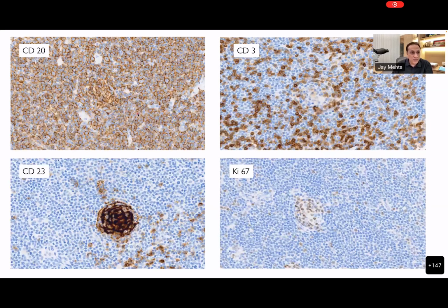So this will mark with CD20. CD3 is typically negative. CD23 will mark the FDC meshwork. And the Ki67 labeling is restricted to the germinal centers, very low labeling in the actual infiltrate.